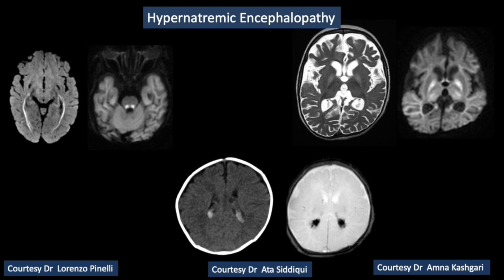Pediatric hypernatremia is an under-recognized imaging phenomenon. The mechanism of hypernatremia is not well understood, but is quite similar to osmotic demyelination associated with rapid correction of hyponatremia. The myelinating white matter tracts and deep gray nuclei are more vulnerable. Brain parenchymal and intraventricular hemorrhage are attributable to capillary fragility and endothelial injury. Due to common pathophysiology, the imaging spectrum of hypernatremic dehydration due to accidental and non-accidental salt poisoning are indistinguishable from one another.